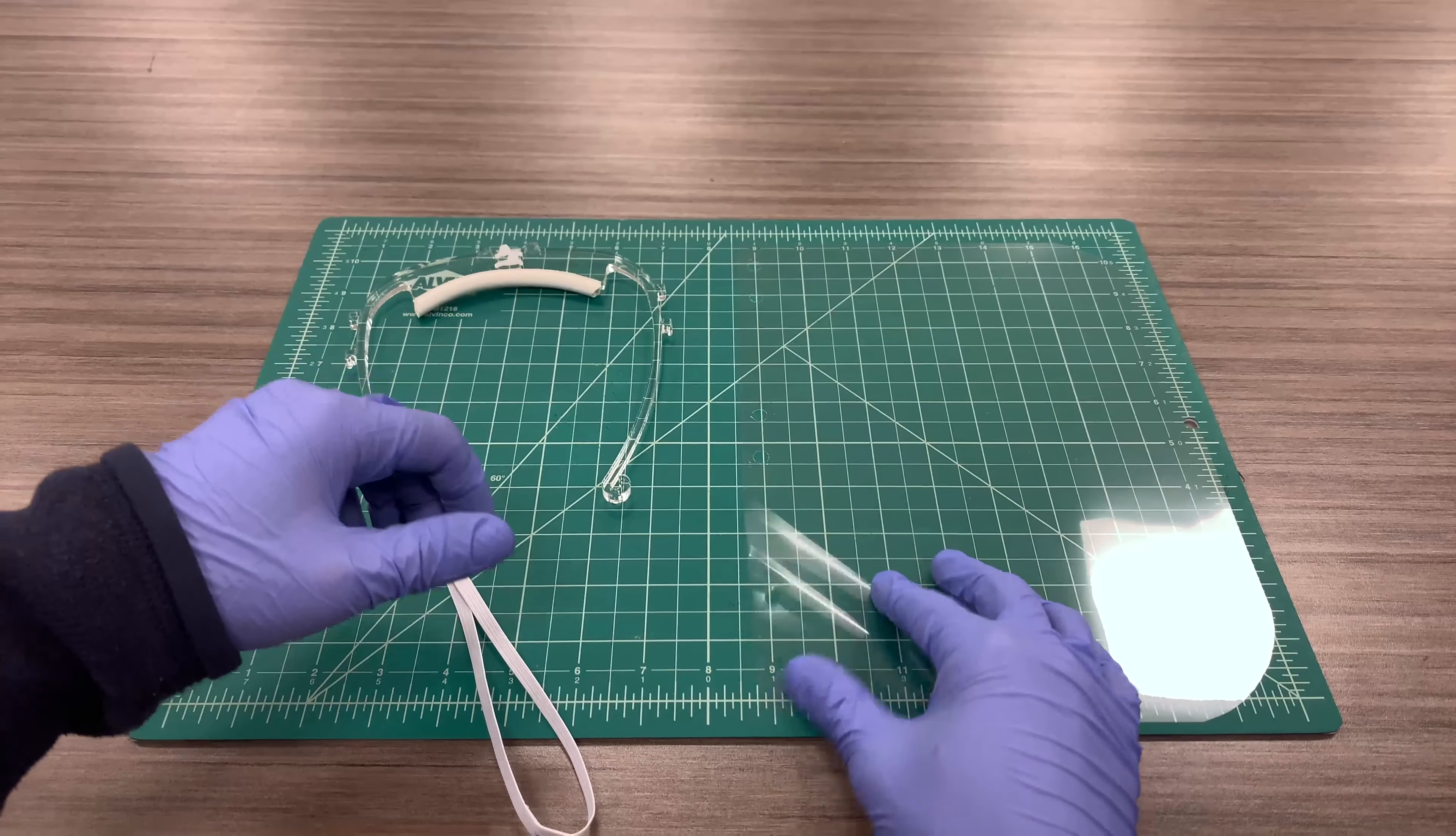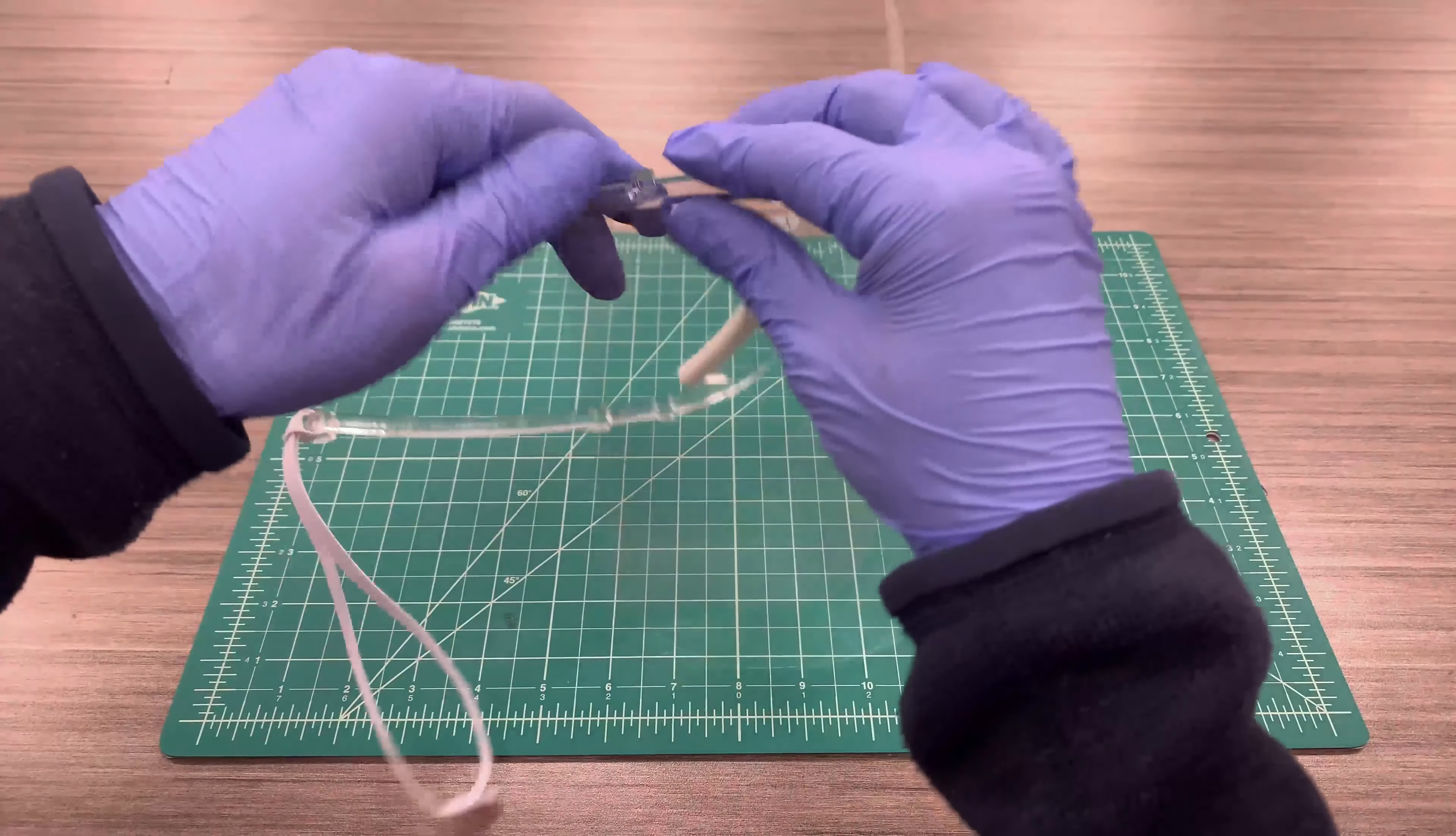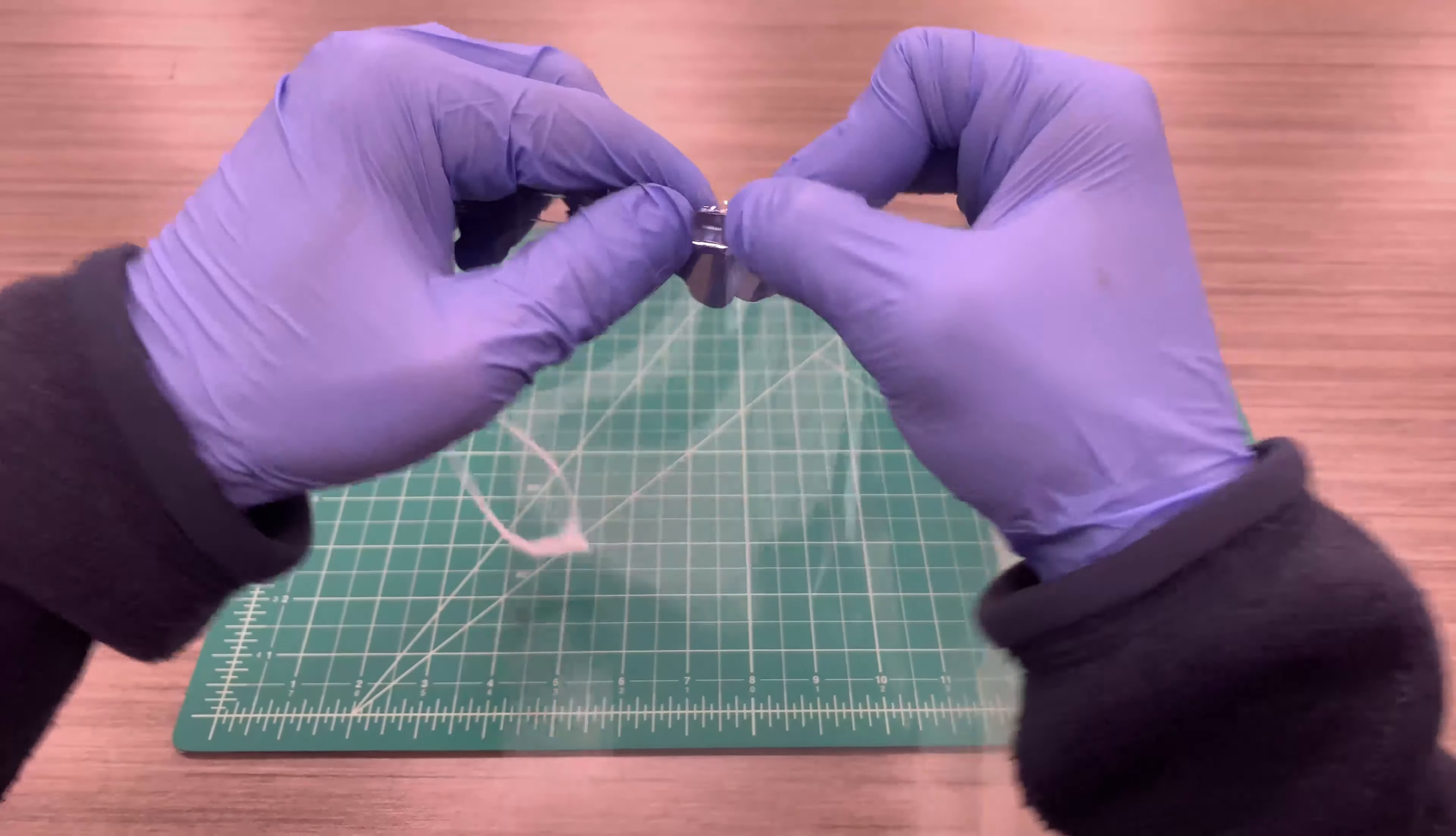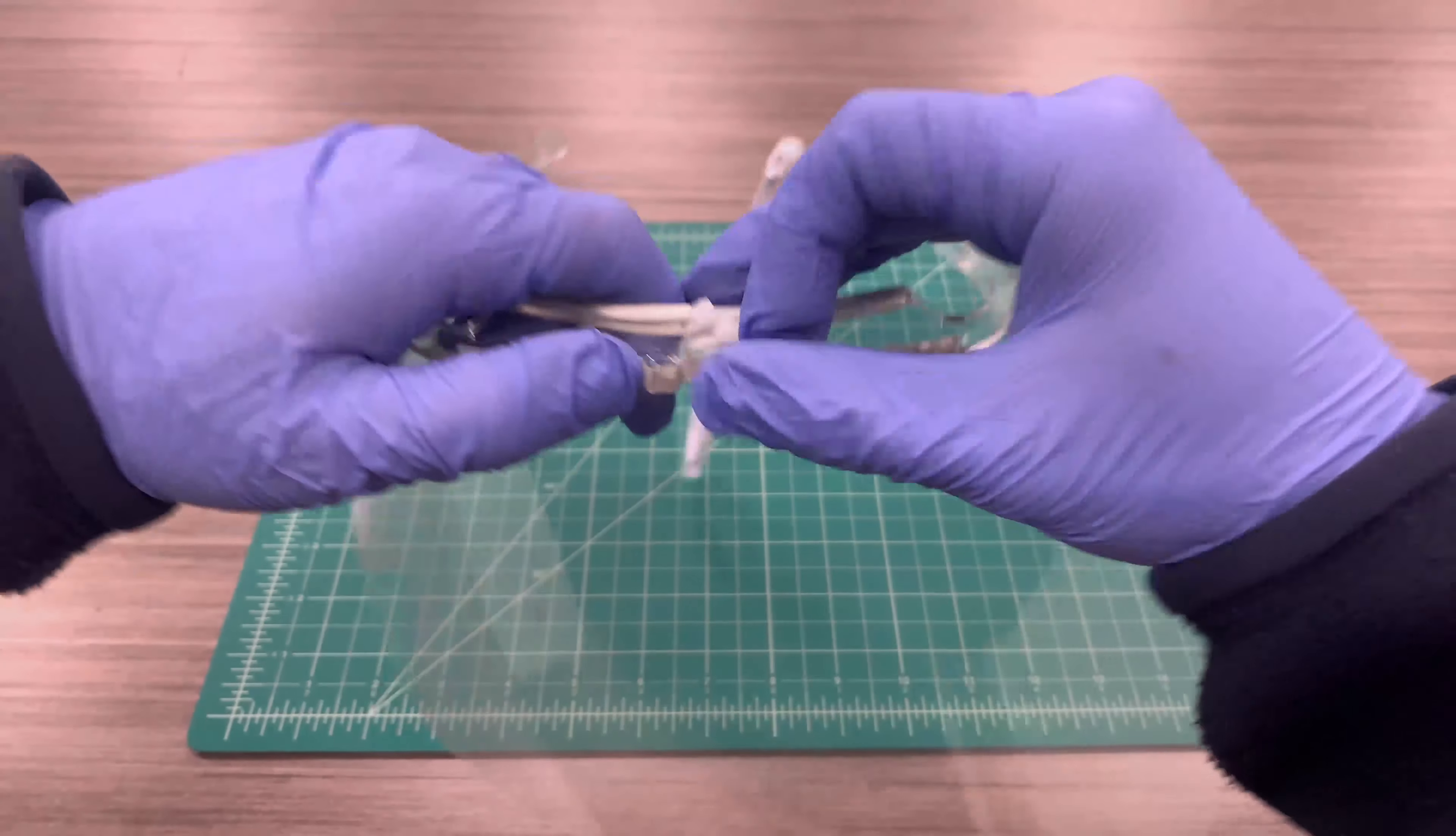All right, now, and finally, we're going to attach the shield to the visor. So you want to start at the end, put it through the first hole, and you just want to walk it along, pressing it through as you get to each corresponding hole.